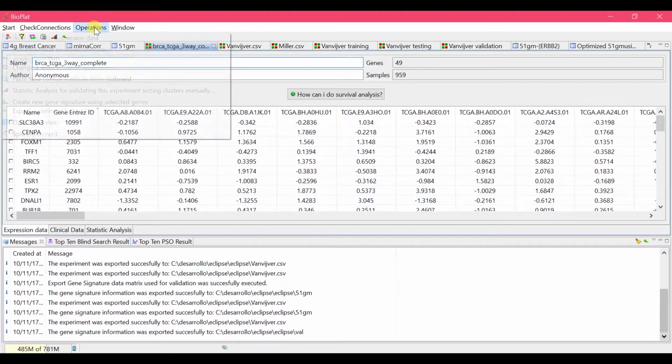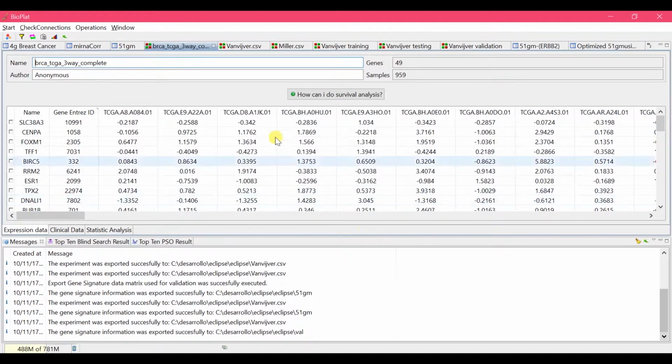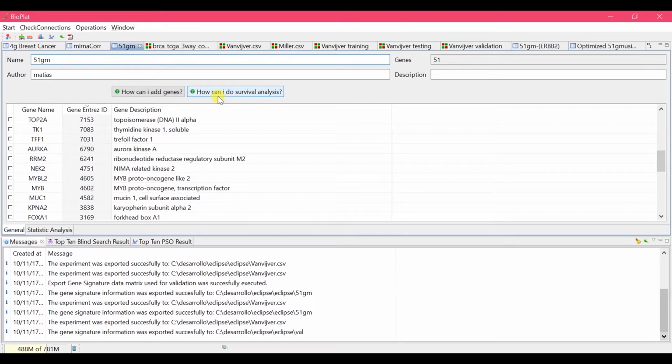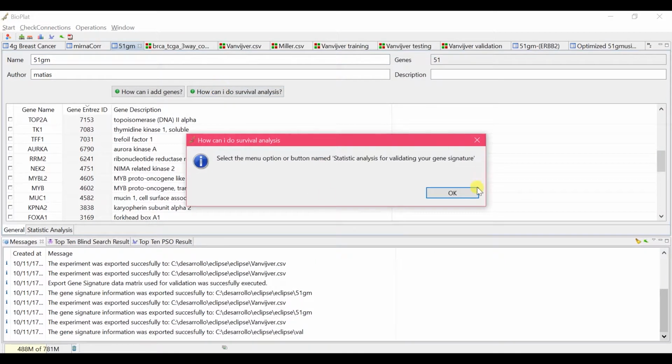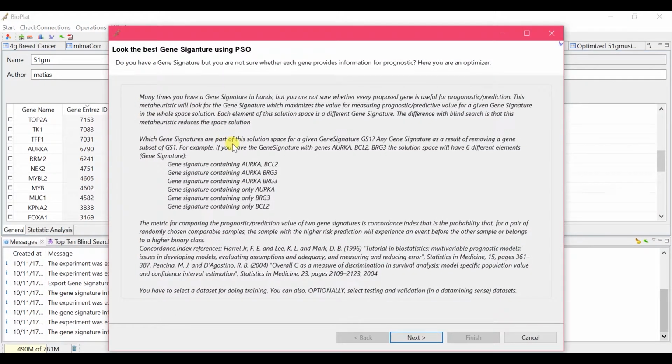You can configure some visual stuff of the platform, and you have available help and documentation inside the platform as a button or text in the wizards with the corresponding academic references.